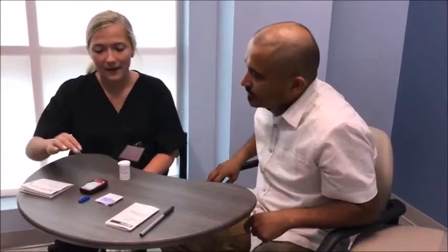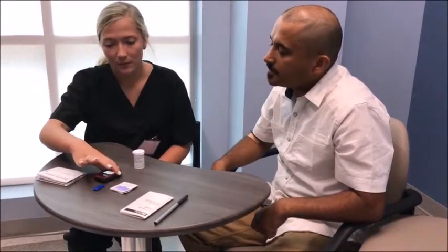All right, so now we're ready to start testing your blood sugar. I'm going to talk about the pieces first because it's important to understand the lancets and the strips. Each monitor is different and comes with a different instruction manual, so if you're ever confused, you can look in it to see how to save results or how to know when the monitor is ready to test.